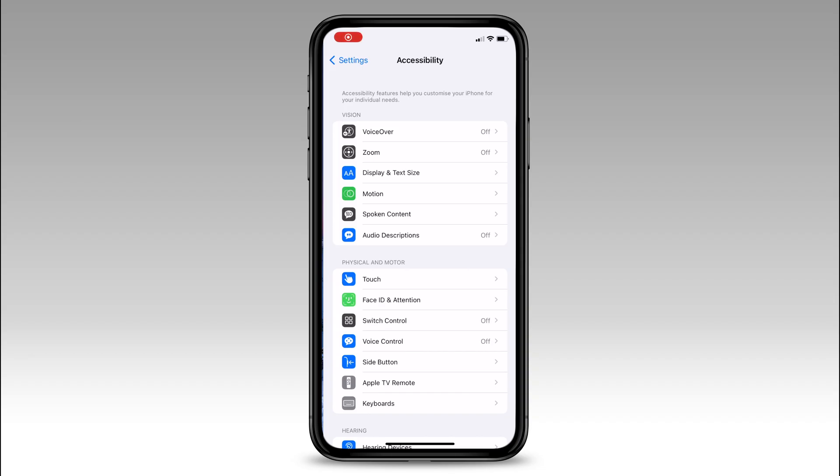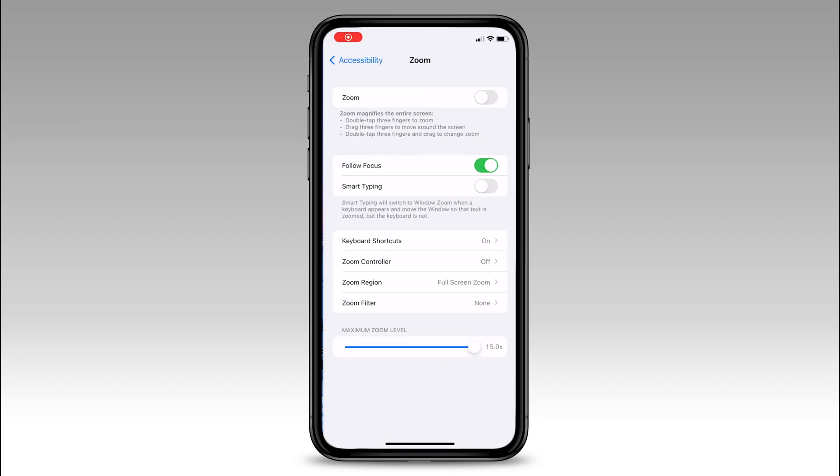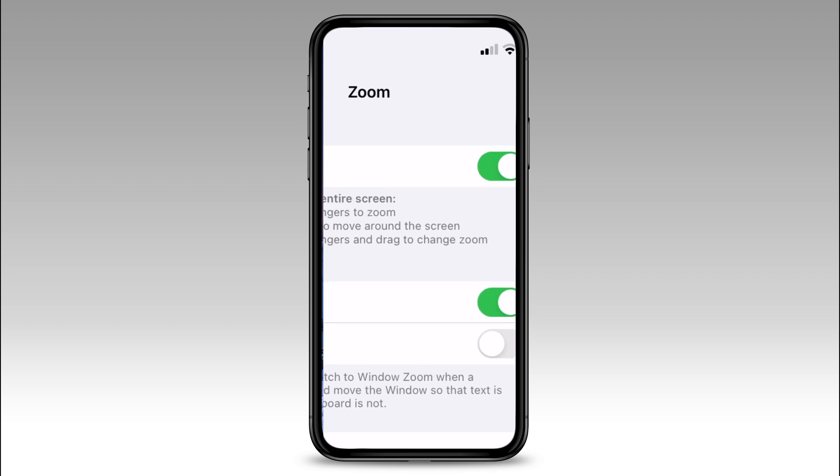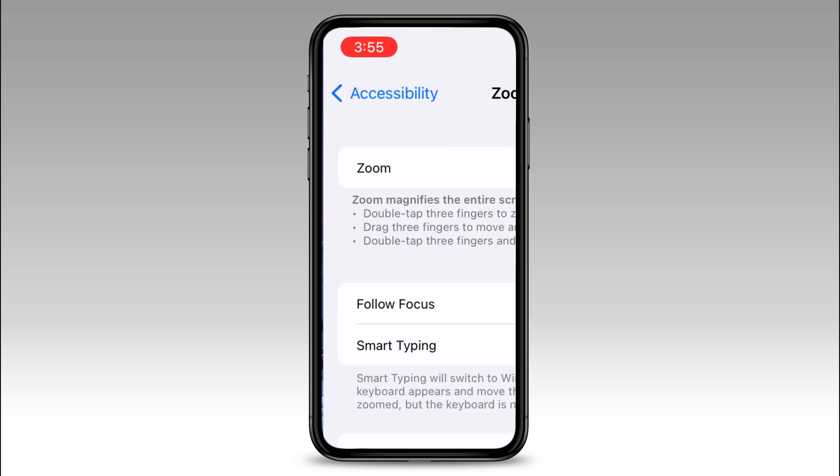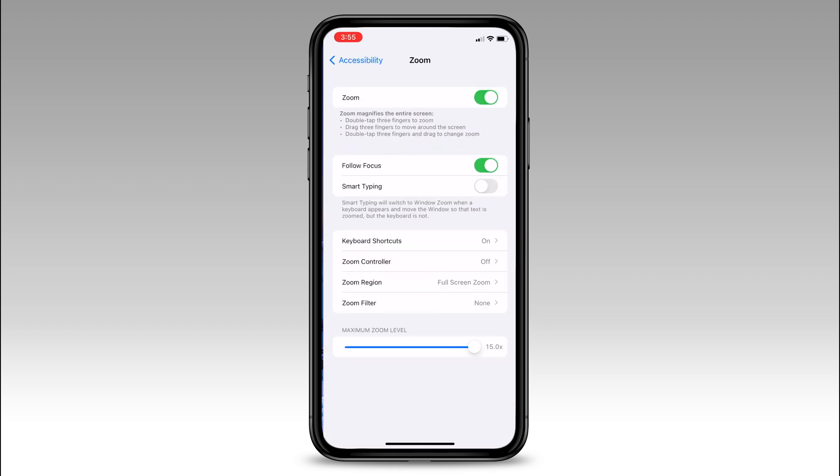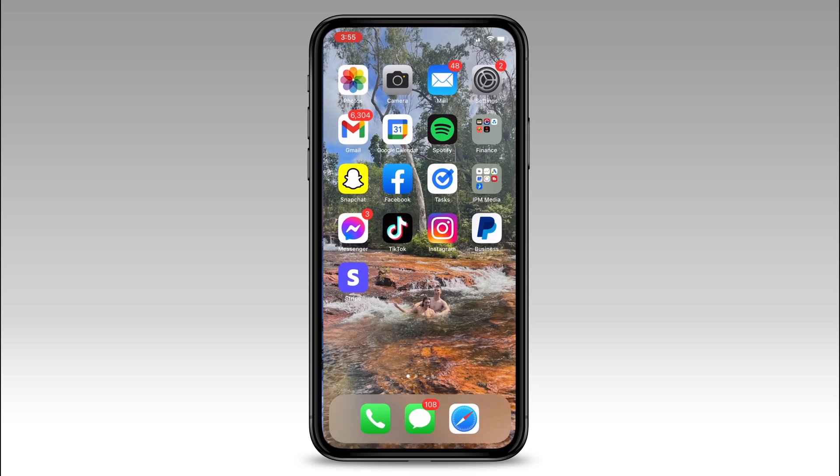Inside the accessibility settings, we want to enable the zoom feature. This will zoom your screen in. Use three fingers to double tap to zoom back out or move around the screen while it's zoomed in.